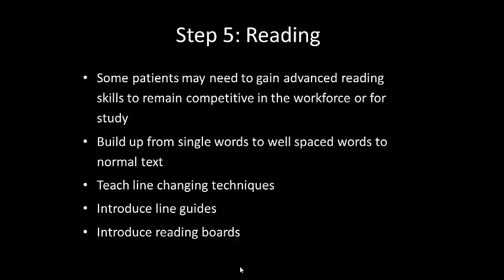And you'll find that these patients are usually younger patients, and also they are much more motivated to be able to read than perhaps an older patient that only requires spot reading for various daily living tasks. So these patients are often more challenging, and you can get to step 5 with them, and that is get them to read fairly fluently. Other things you need to do is teach them line changing techniques, which I'll show you in a moment, and also introduce line guides and possibly reading boards.